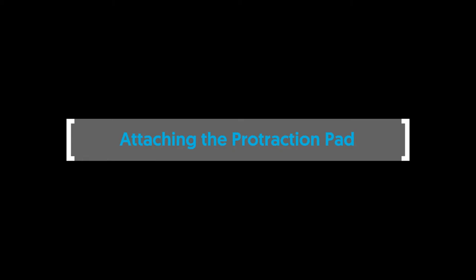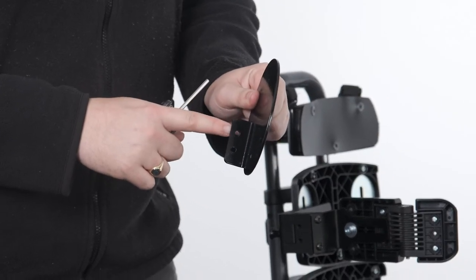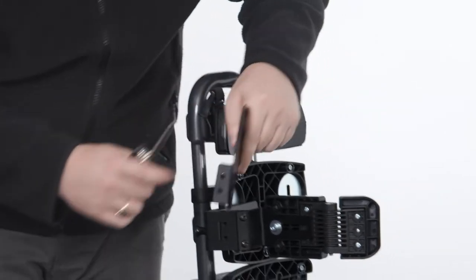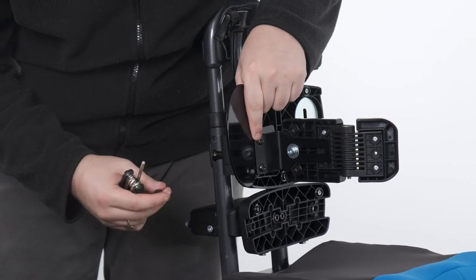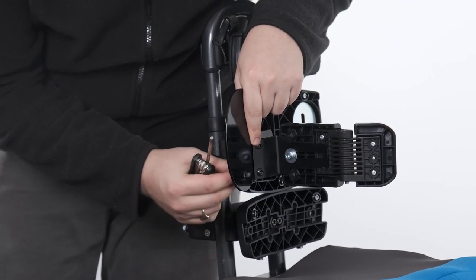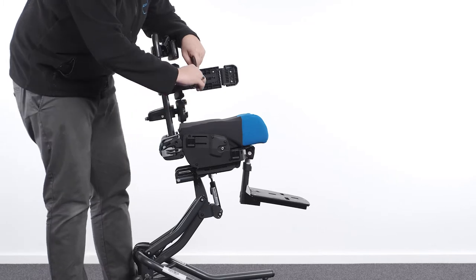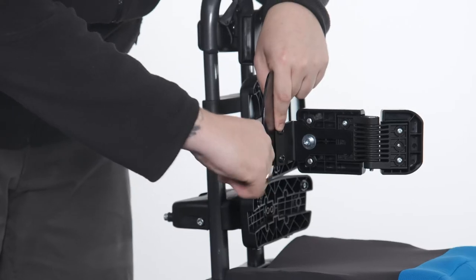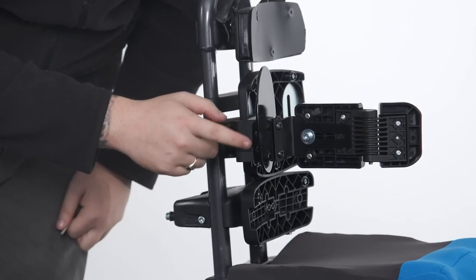Attaching the protraction pad. To attach the protraction pad, align the two holes of the protraction pad platework with the corresponding holes of the lateral bracket, ensuring the bend in the platework points away from the lateral pad. Place the two bolts through these holes and secure in place on the rigid bracket. Secure the bolts with two nuts provided and a 10mm spanner.